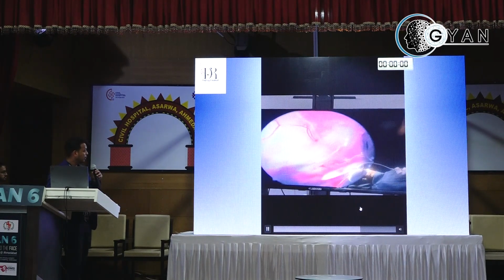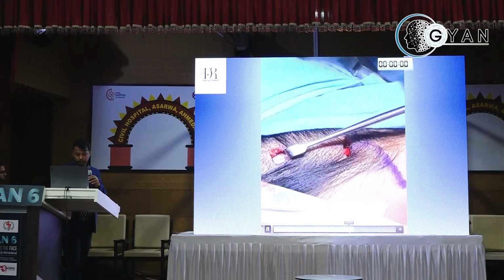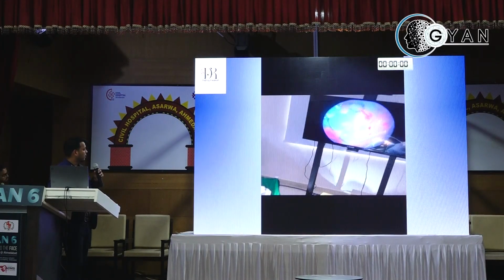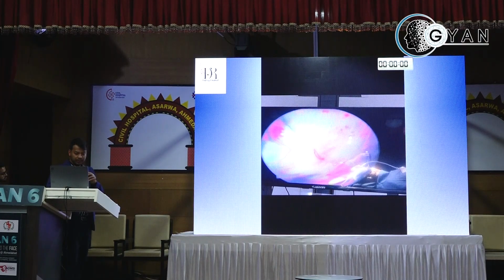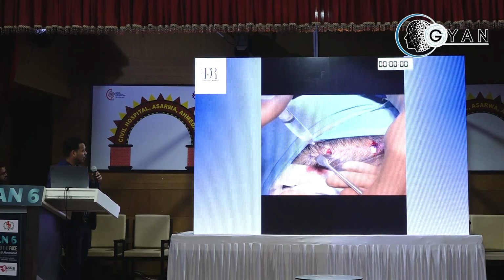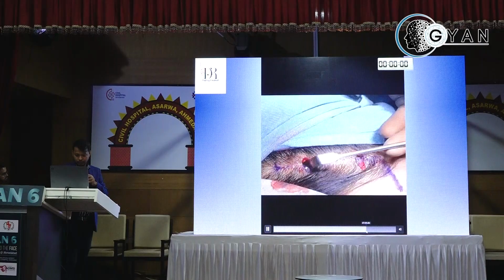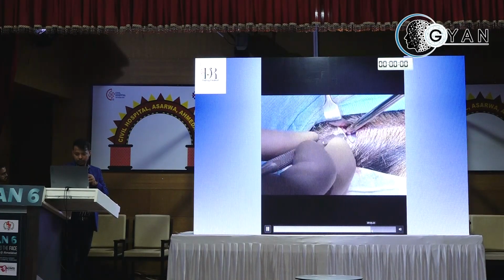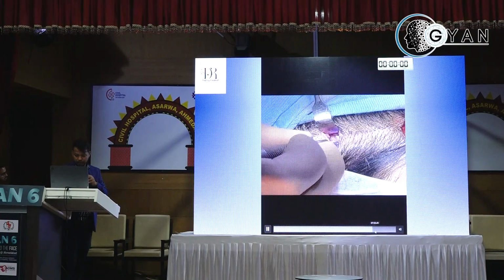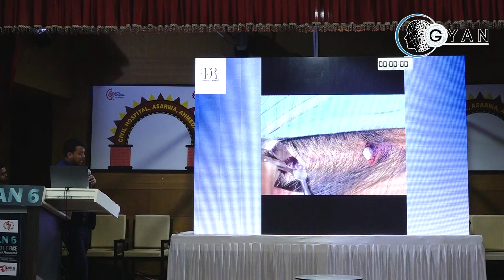Now you see the marking in the endoscope, in the same incision. Yeah, now we go through the same incision and see the markings with the endoscope. Once the markings are done, we give hydrodissection with tumescent anesthesia, which also helps with vasoconstriction, where the muscle is below the fascia. In direct vision, we give the medial and lateral cut, and after that the side borders, with the help of the endoscope.